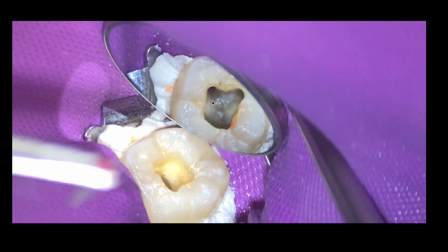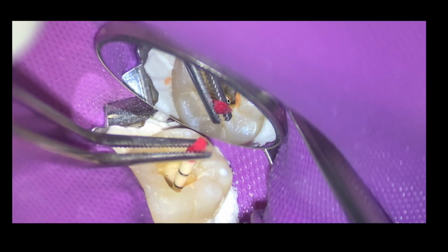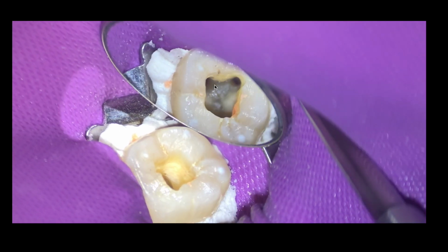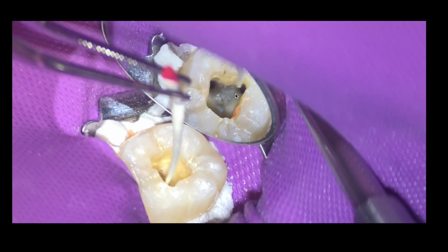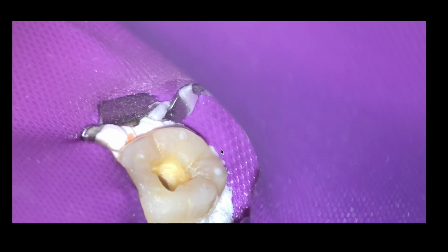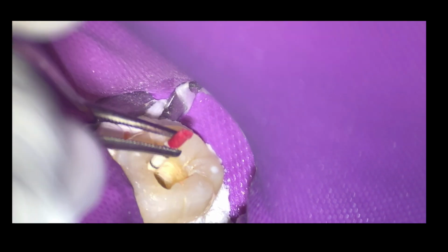So I did trough briefly before. This is little remnants of calcium hydroxide just on the pulpal floor. I'm not too concerned about those, and they're actually little parts that really dried out. A little bit of calcium hydroxide just in the isthmus there. I'm not too concerned about that. I did trough that before looking for a middle mesial, but there was none, if you were wondering. So we dried it out. I'm going to keep drying like crazy, make sure it's super dry.